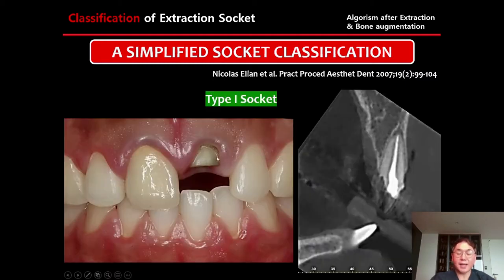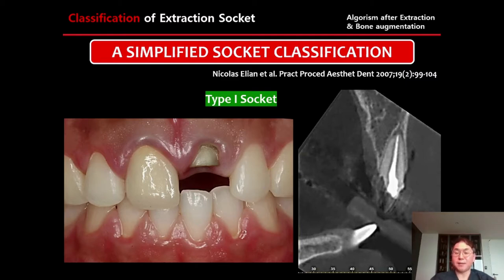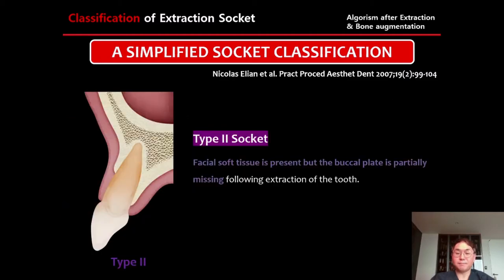Type 1 socket: sound soft tissue and sound bone. The palatal soft tissue and buccal plate of bone are at the normal level with no recession. Here is a clinical case — upper left central incisor. On CBCT, we can confirm sound labial bone level without any recession. This is a Type 1 socket.